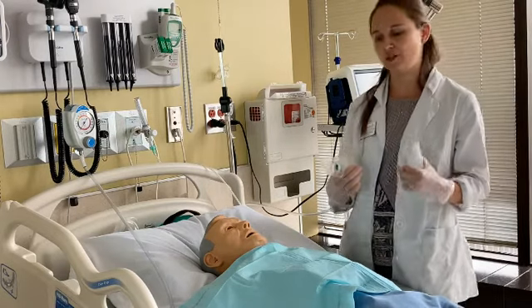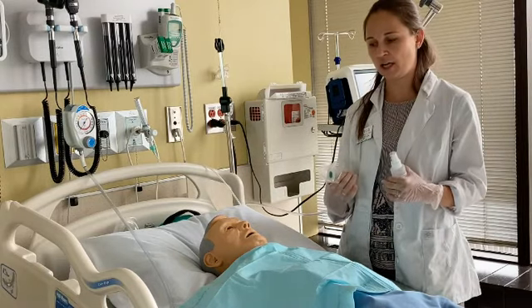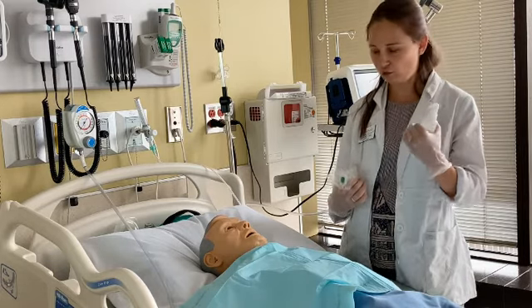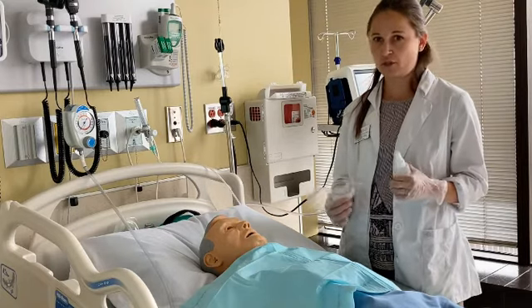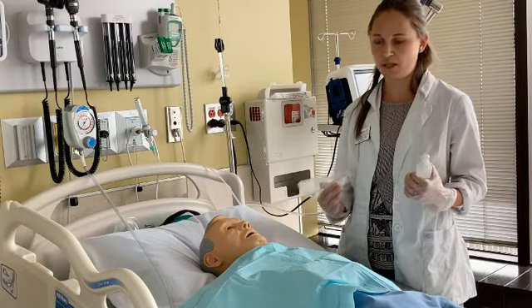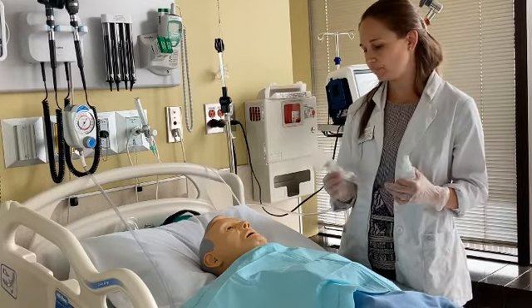So for example, a patient who is actually conscious but who's requiring a lot of suctioning, and I don't want to damage the mucosa, and I don't want my patient to be in a lot of distress when I'm inserting the tube for suctioning, that could be an option. Another reason to insert a nasopharyngeal airway could be by request of the physician if this patient requires a bronchoscopy and it's really hard to advance the bronchoscope in the nostrils.